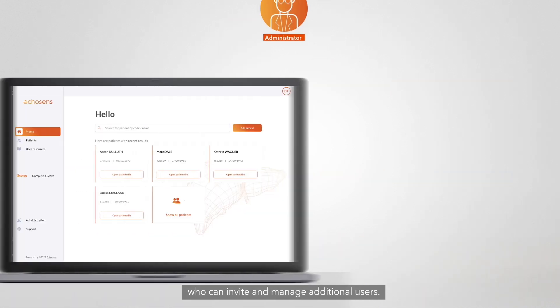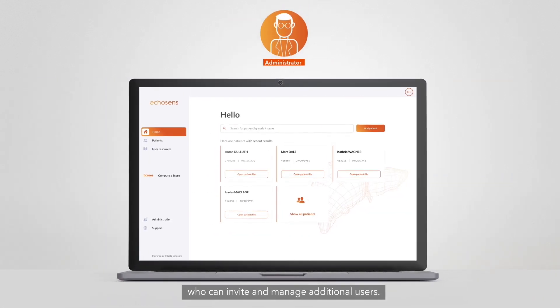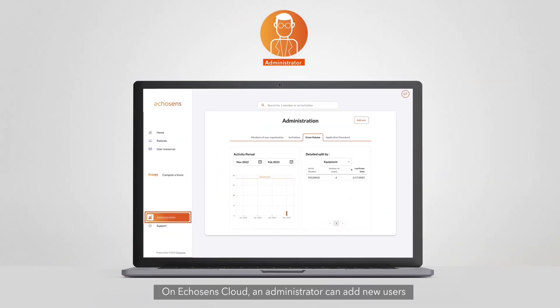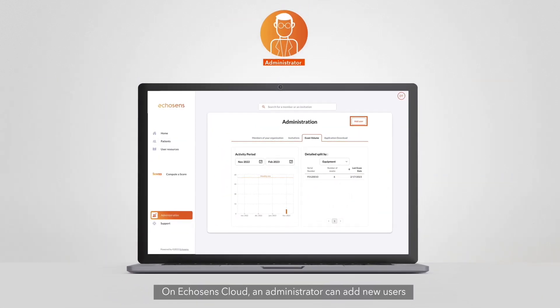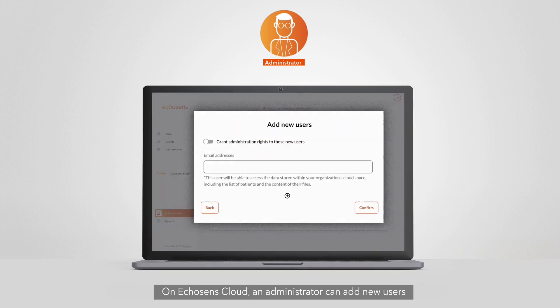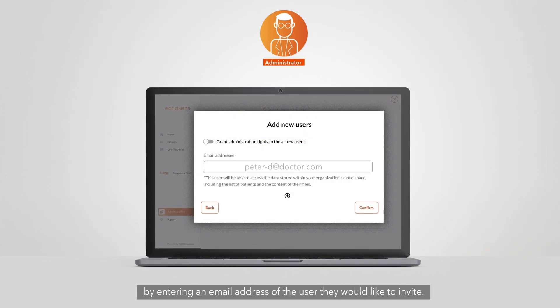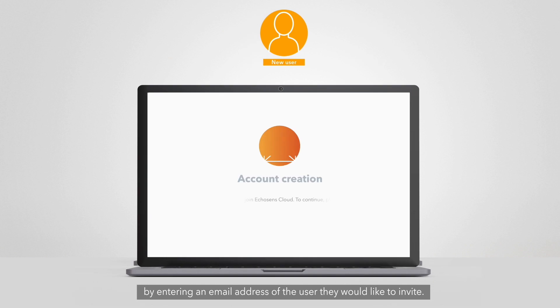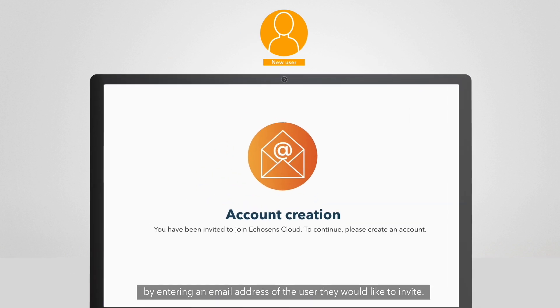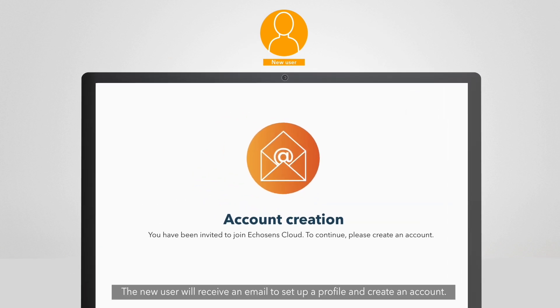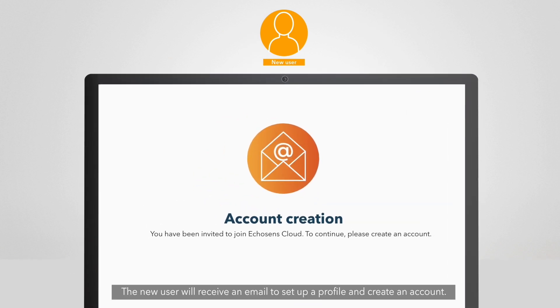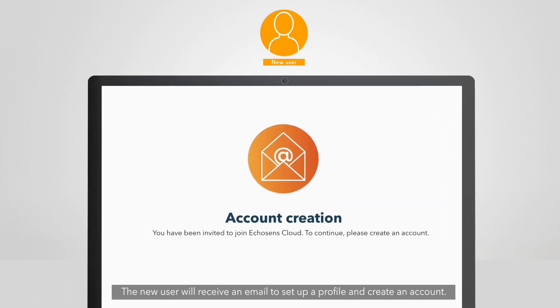On Echosense cloud, an administrator can add new users by entering the email address of the user they would like to invite. The new user will receive an email to set up a profile and create an account.